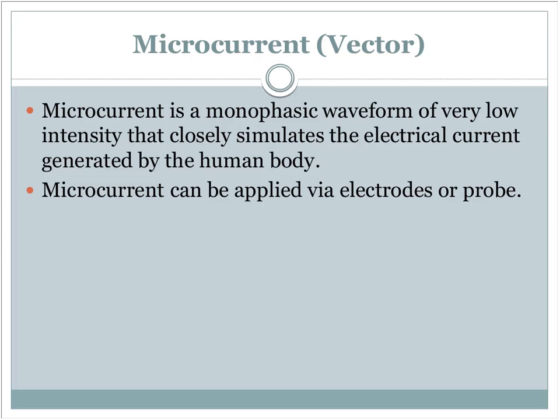You can do it for the muscle contraction, or you can do it for, well, I don't know if I do it for high volt. That might be uncomfortable for you. But I've done this to find trigger points or to directly treat trigger points. All you do is you put a 2-channel, like a pre-modulated, and you put one electrode on the patient and one electrode on your wrist, on the back of your hand, and you touch the patient.